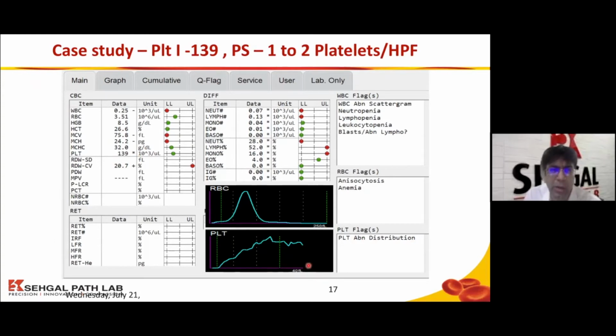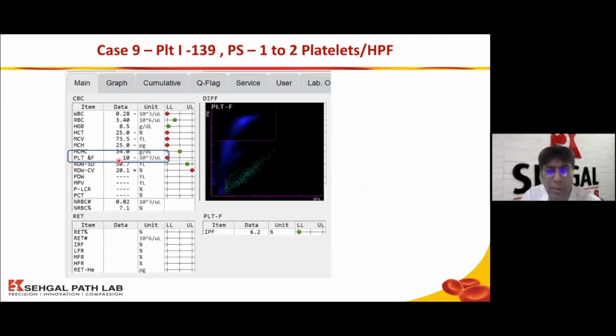Based on this, what we did is we made a peripheral smear. Now, the peripheral smear is showing only 1 to 2 platelets. That means the count looked somewhere between 10 to 20,000. So we had this flag. The machine is giving a count of 1,39,000. This is a very odd scenario, but interesting to learn from. We ran the optical platelet count. It came to 10,000. Now this was very surprising. We had the opportunity, we ran it. This was matching with the smear.